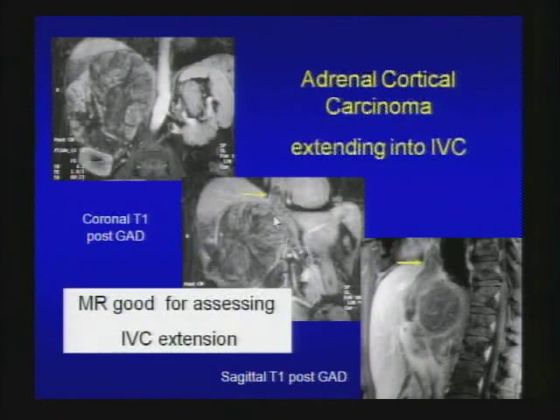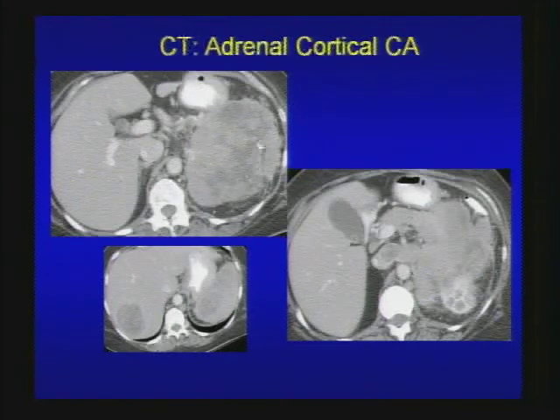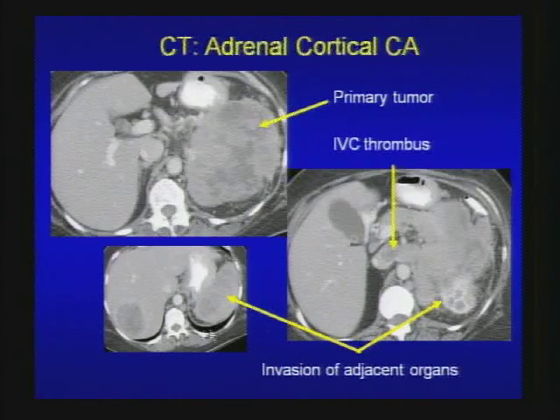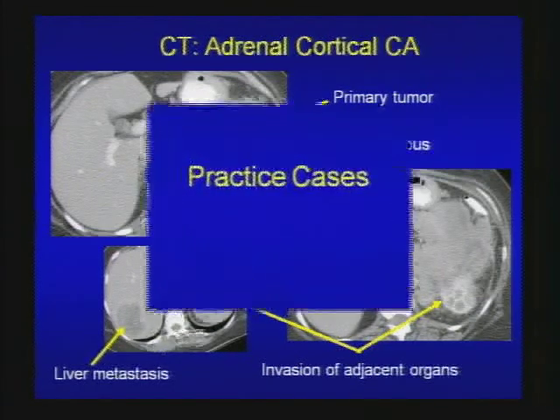MR is very good for assessing IVC extension. Another CT case of adrenal cortical carcinoma: large heterogeneous mass — did you notice the IVC thrombus? And invasion to adjacent organs — the left kidney and the spleen — and distant metastasis to the liver. Aggressive tumor.